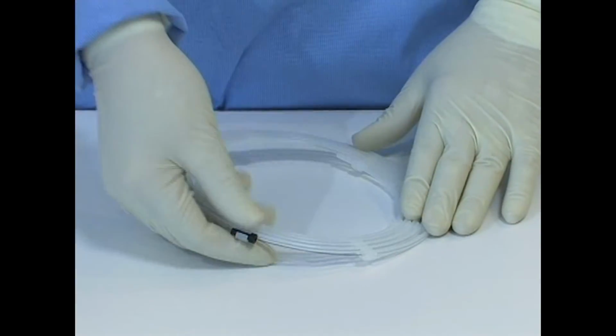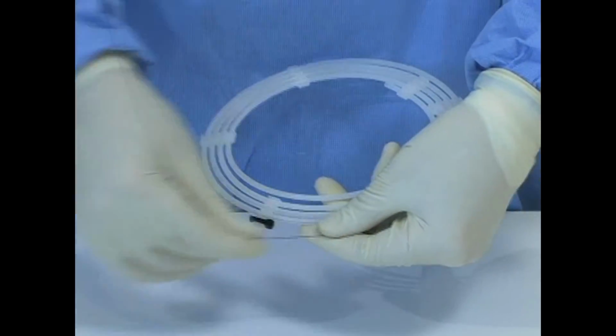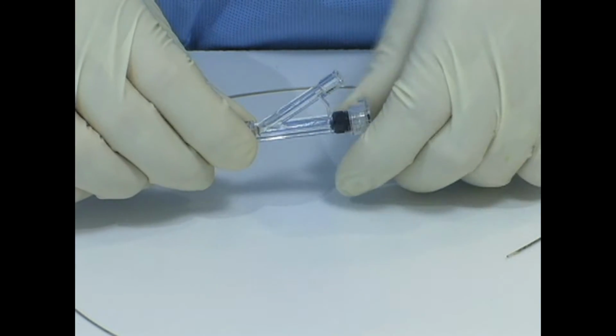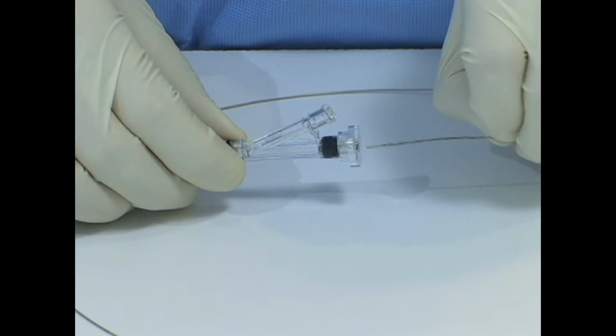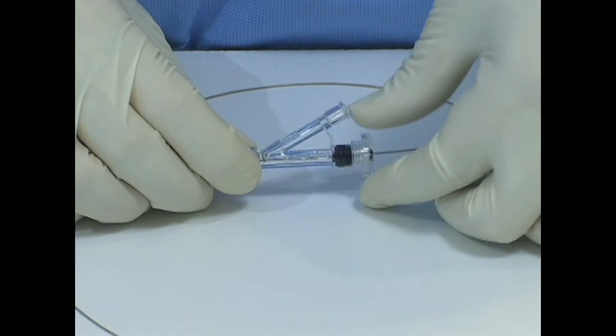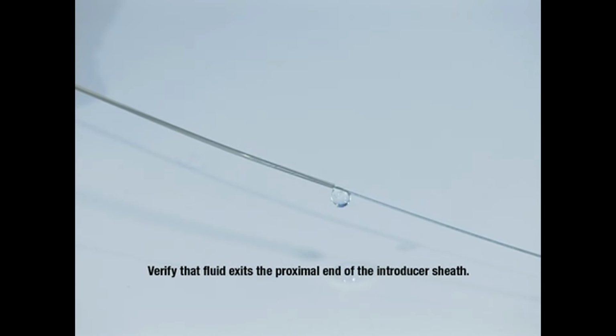Open the device packaging in the sterile field and remove the Solitaire AB device from the carrying hoop. Loosen the RHV and insert the distal end of the introducer sheath partially into the RHV connected to the microcatheter. Tighten the RHV and verify that fluid exits the proximal end of the introducer sheath.